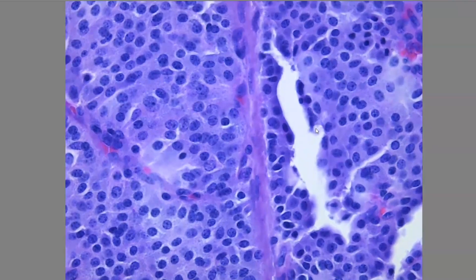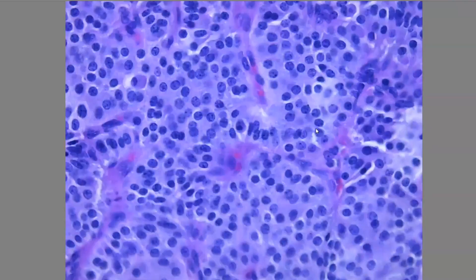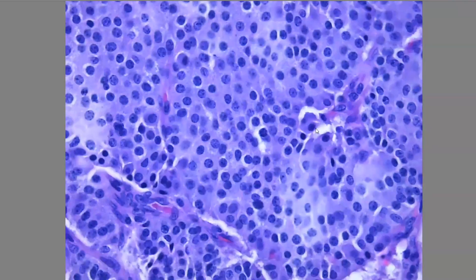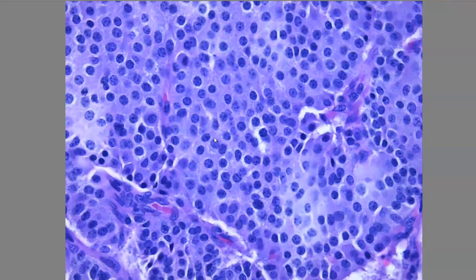Let's look around and see if there are any other features. As you can see, this is a typical carcinoid tumor, so we won't find many mitotic figures. In atypical carcinoid, we would find more than two to ten mitotic figures, but here I can barely find even one. We can see more of the salt and pepper chromatin appearance throughout these cells.